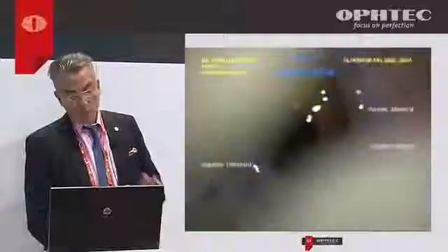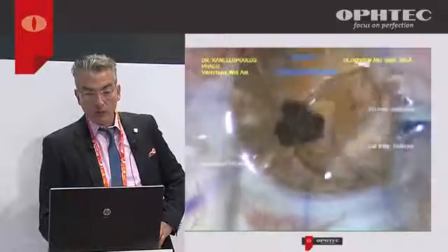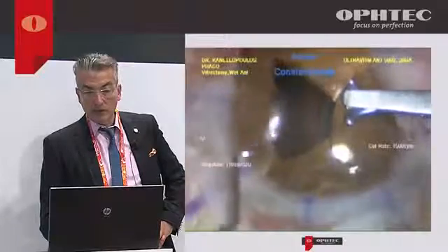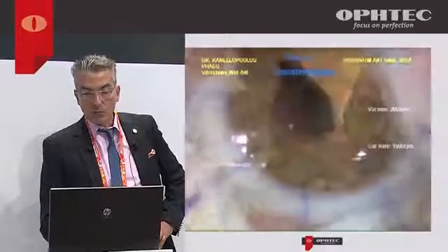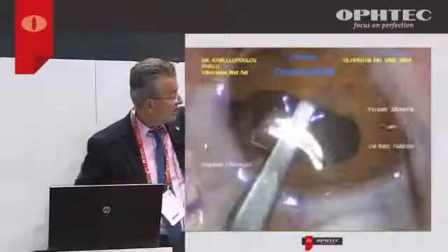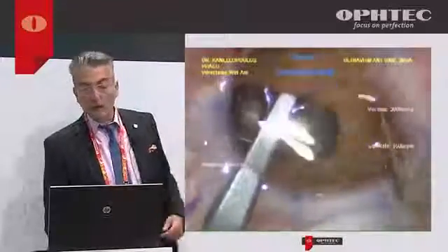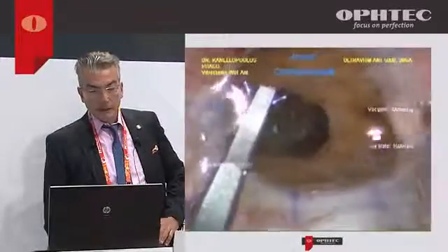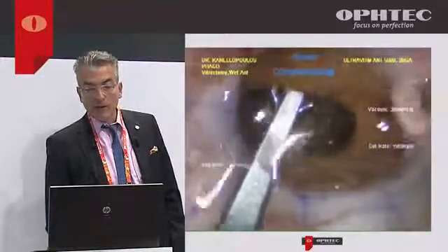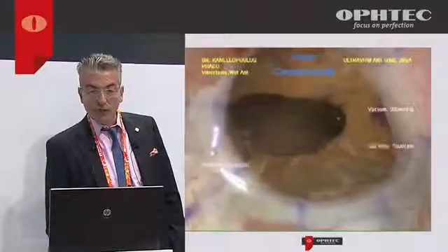Same technique. I'm right-handed, so I prefer to do the left hand enclavation first, and then grab the lens with my left hand, swift with the enclavation needle, the iris around the lens, guesstimate here. And you can see it's a little challenging because there's a lot of iris atrophy. And during the enclavation, I'm creating a few iris holes. But it has quite a leeway to allow you to enclave a significant amount of iris.